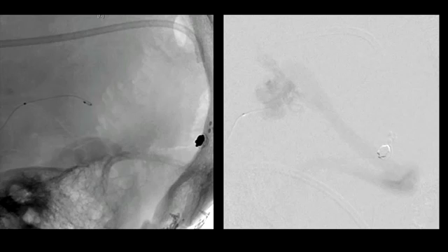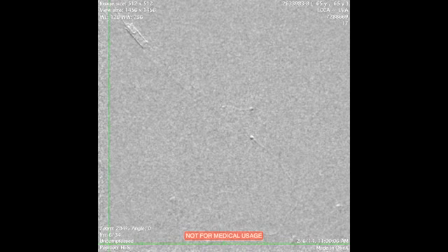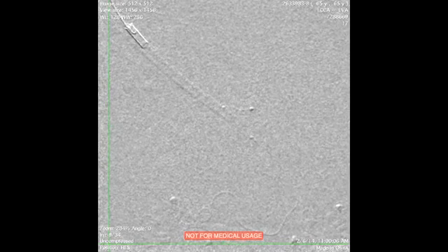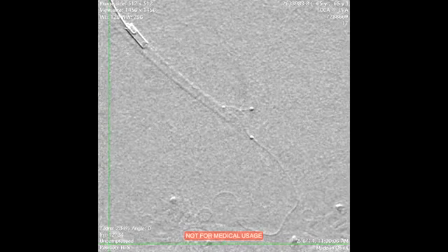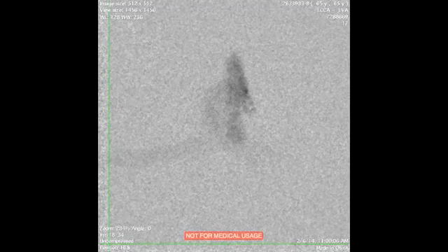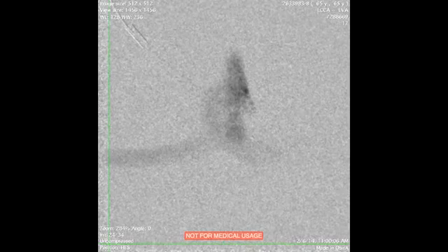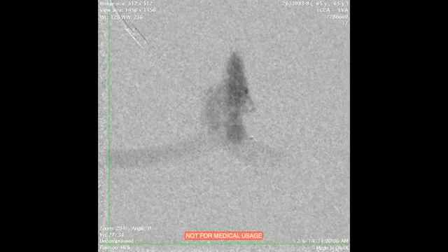And you can see the shunt valve and the catheter from the previous VP shunt the patient has had placed in the past. But again, important to realize how the microcatheter has been navigated all the way to the fistula point. This is a microcatheter angiographic run which was completed right before the embolization, and you can see this directly filling the fistula pocket, the vein of Galen, the straight sinus, and then the right transverse sigmoid system.